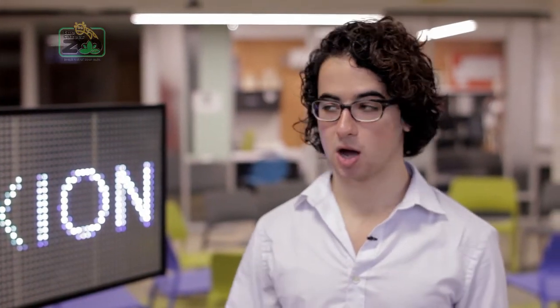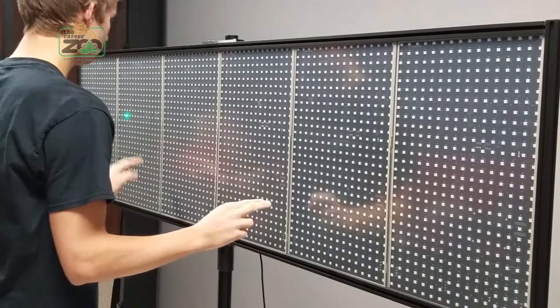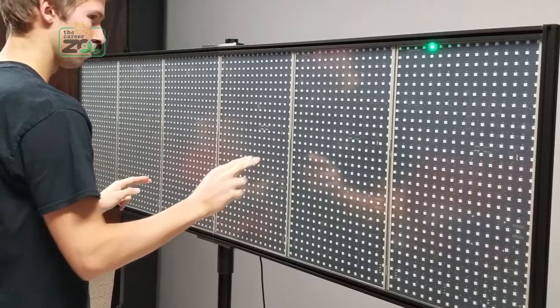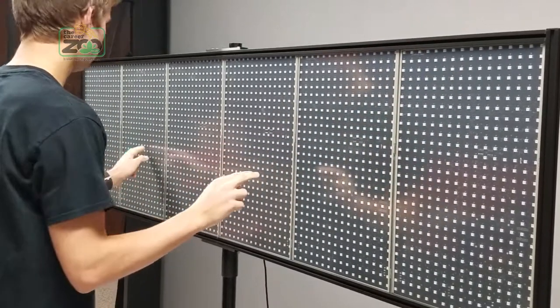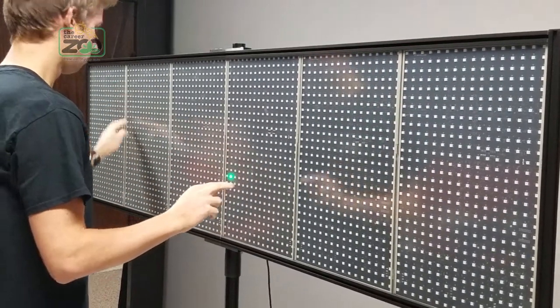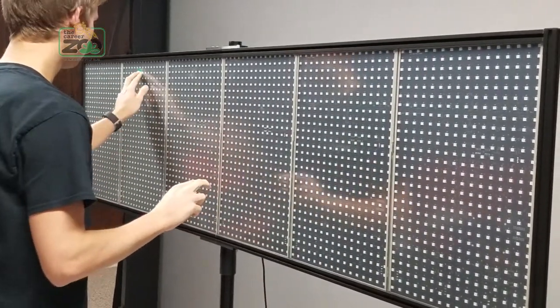Alright, so here we have the Reflection Edge. This is actually a prototype. It's a two by six foot touchscreen that collapses into a duffel bag and deploys in minutes.